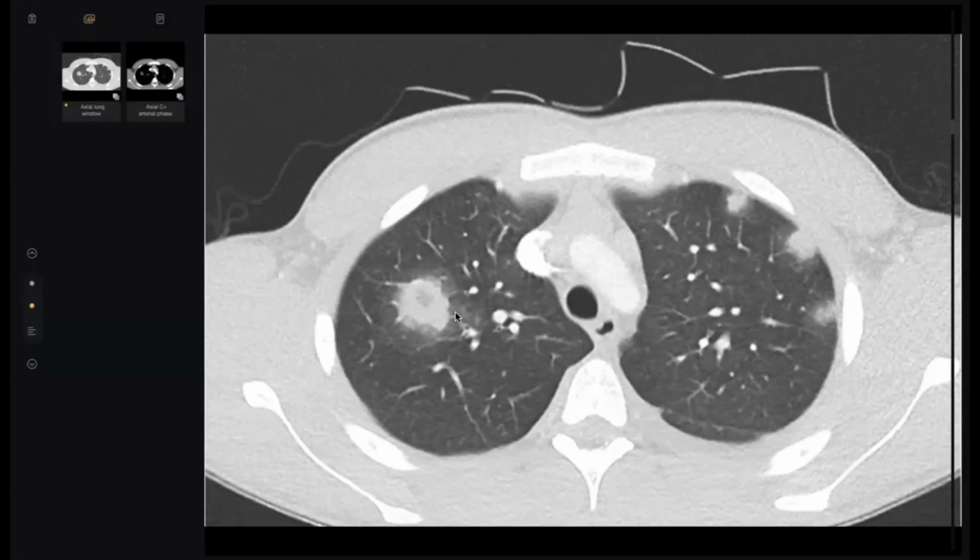Because the patient presented with fever, at the top of my list I am thinking about tuberculosis. In this case, I will urgently communicate my finding to the referral doctor, isolate the patient, and screen the contacts and relatives of this patient. Other differential diagnosis, if the patient is a known case of a primary tumor elsewhere, I am thinking about cavitary metastatic lesion. Otherwise, because of the history of fever, other atypical infections such as fungal infection or atypical pneumonia. What else other than fungal infection?